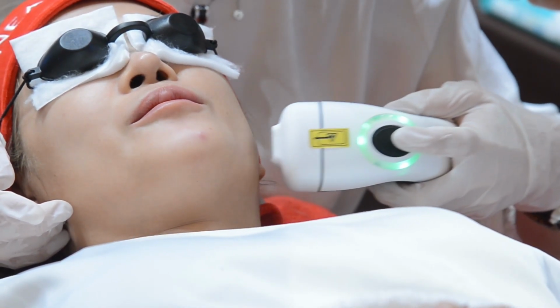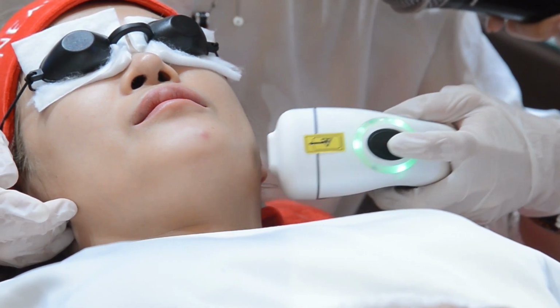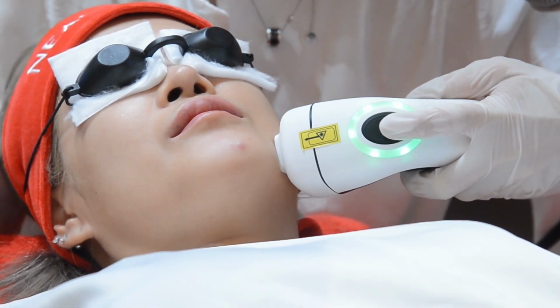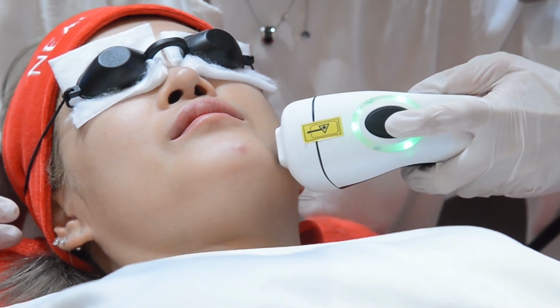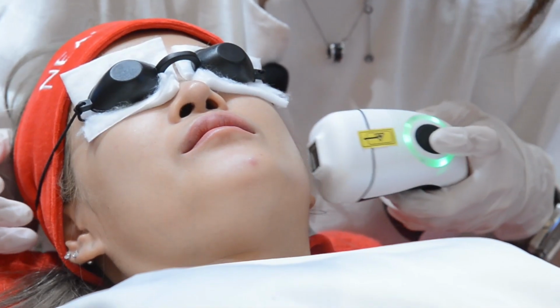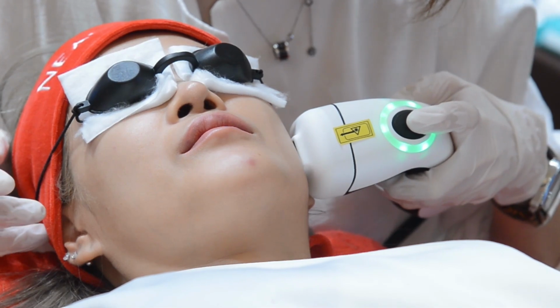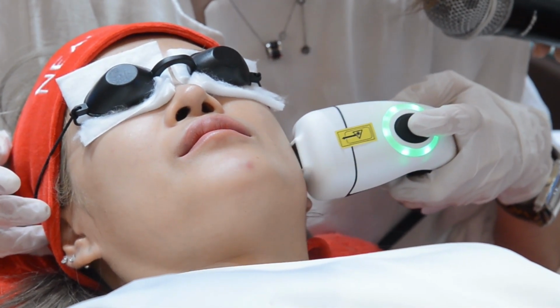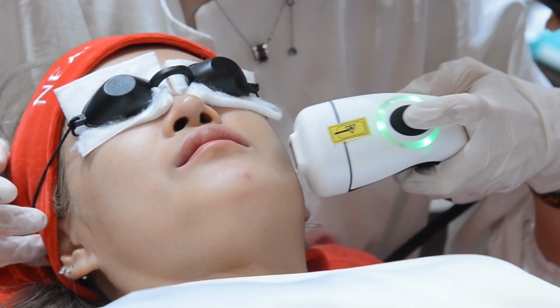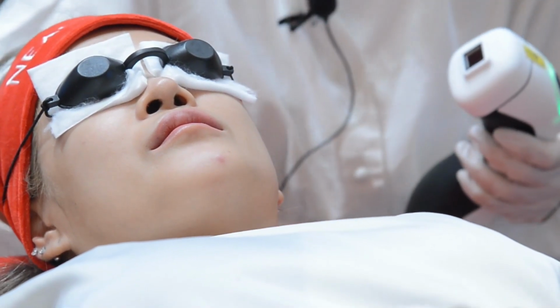It's okay. Then I move on to the next one. Next one. Make sure that each shot is very close, with a 45% overlap, so that you don't miss. Can we have the patient turn her face a bit to the right side?